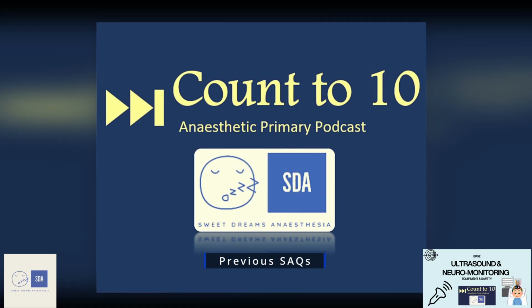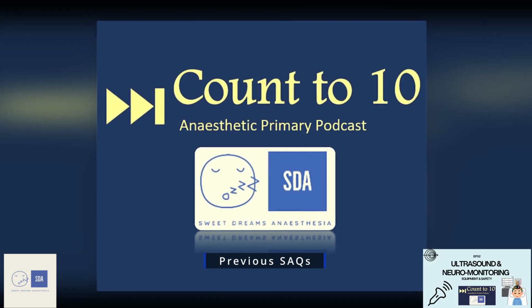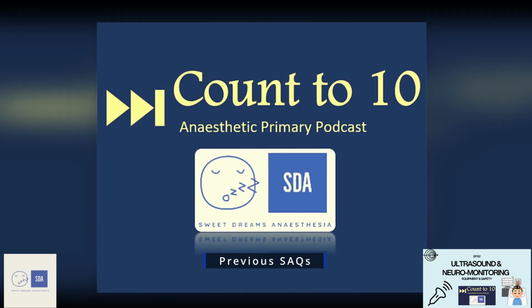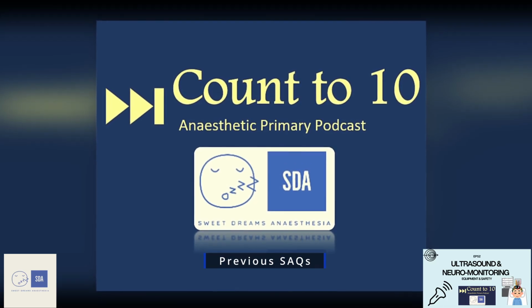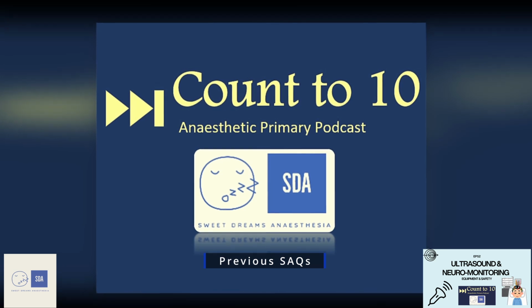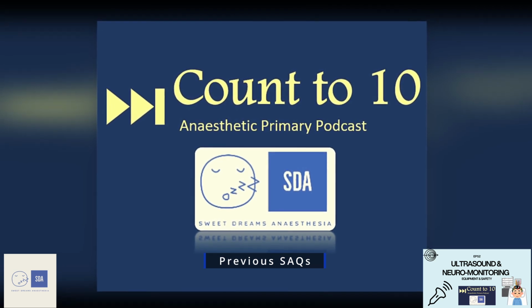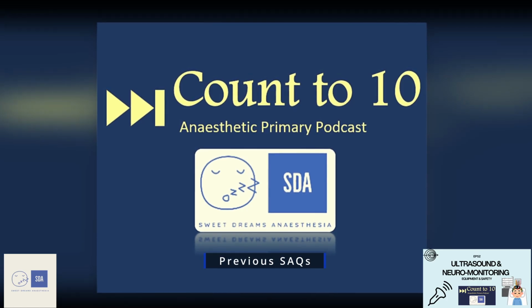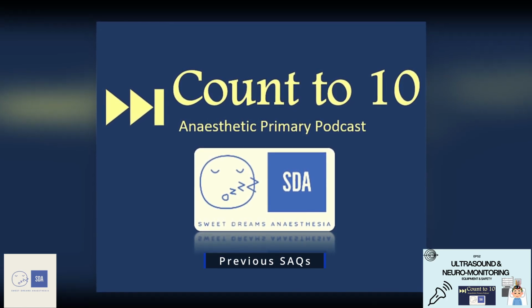And with basic high school maths, we can convert that diameter into an area using pi times r squared. So now we have the first component of our equation, which is the LVOT area. We now need the second component, which is the velocity of that blood flow in that LVOT area. And this is where Doppler comes into use.